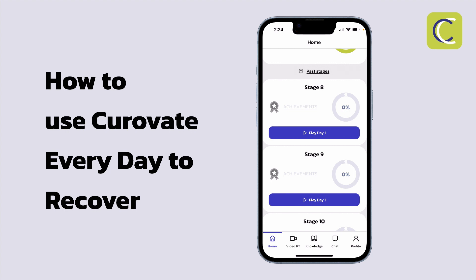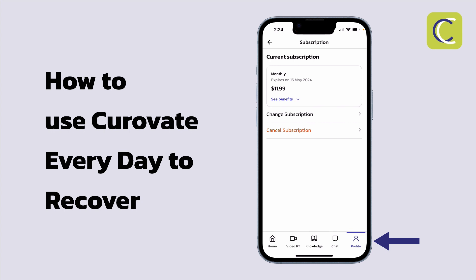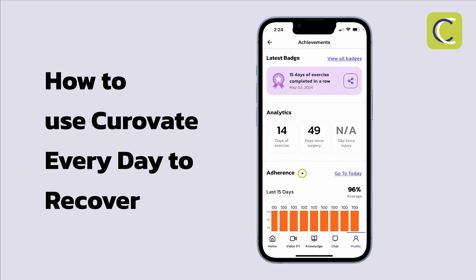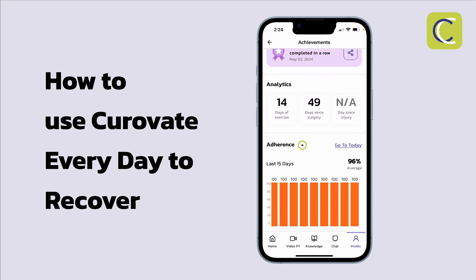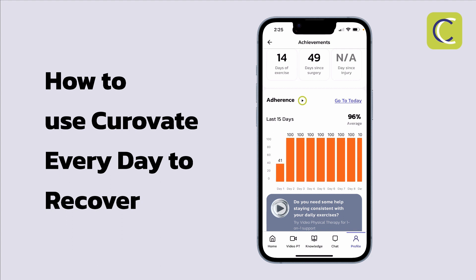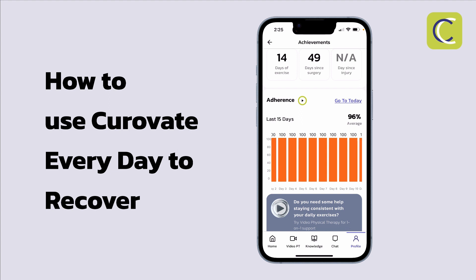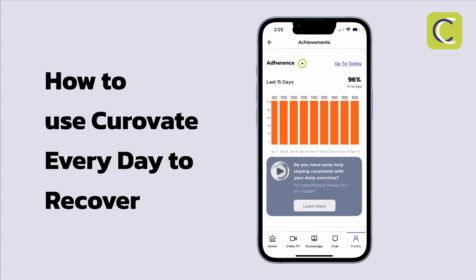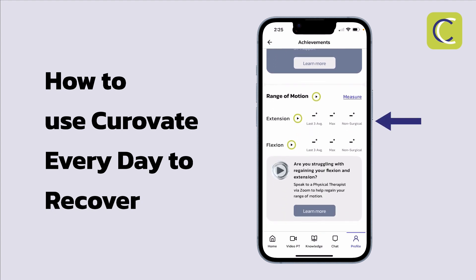It's also a good idea to select the profile at the bottom right and take a look at your achievements. On the achievements page you can see your badges at the top, your number of days of exercise, and very importantly a graph showing your adherence — how consistently you are doing the exercises within the app. In this case, averaging 96% adherence means I'm doing really well, with only one day where I struggled at 41%. This graph keeps a tally of all your exercise adherence.